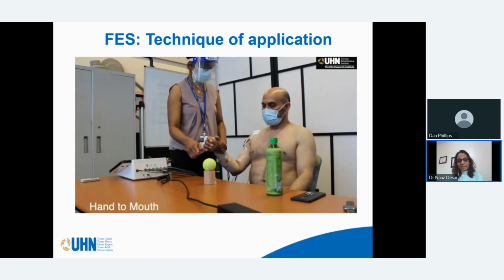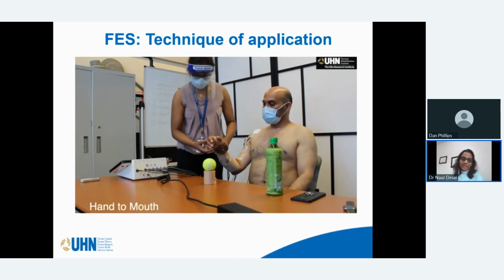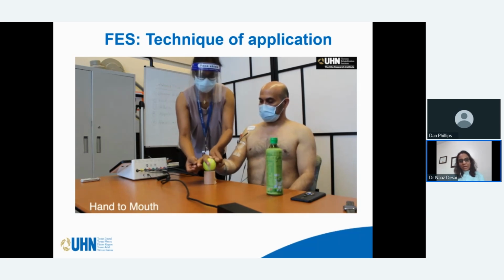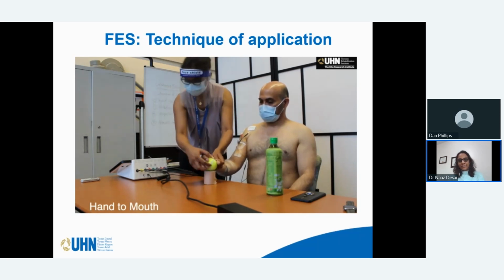This is a different task that we are training now. So this is a hand-to-mouth task. Here, the instruction for him is to lift the tennis ball off the table, pretend as though it's an apple, bring it to his mouth, and then put it back down. So very functional in nature.